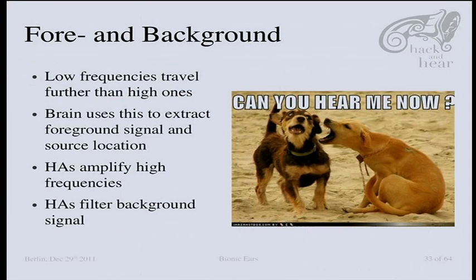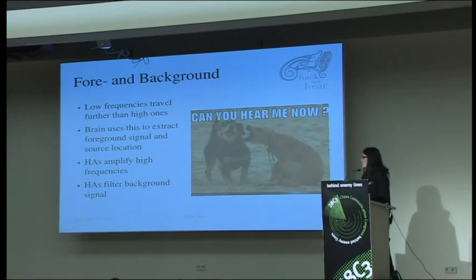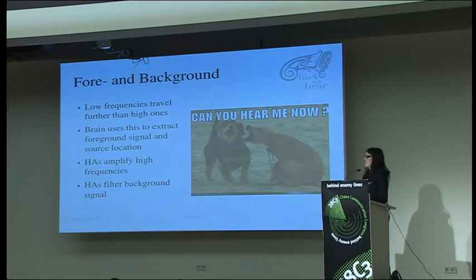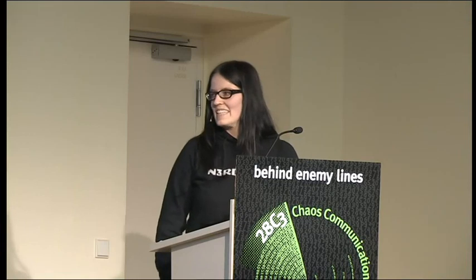Generally it's really hard to extract foreground from background noise, because foreground noise has all the high frequencies and background noise doesn't. And if you don't hear high frequencies at all, everything is one blob of sound for you. Hearing aids help with that, because they mostly focus on high frequencies and have filters to filter out the background signal. But that doesn't really help so much, because those situation recognitions tend to fail as well.